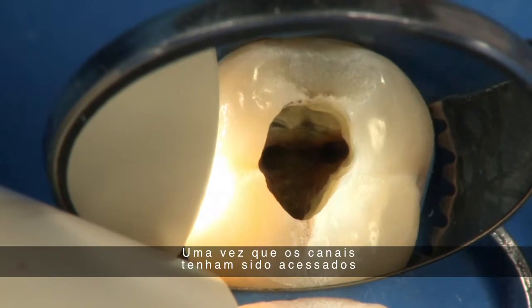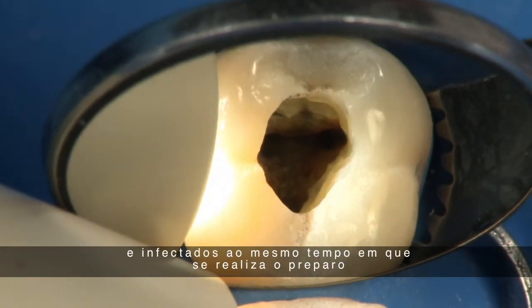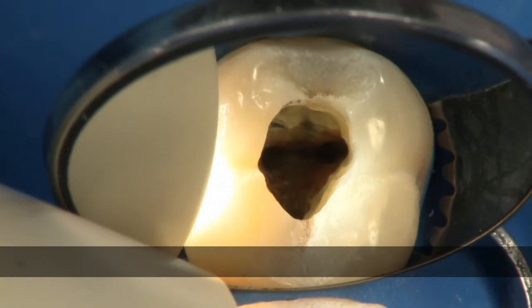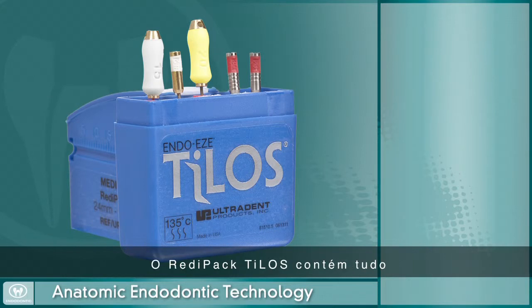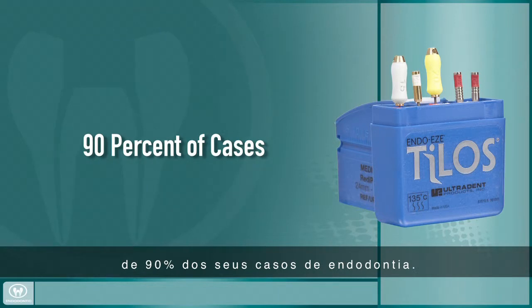Once the canals are accessed, it's time to begin instrumenting to remove all infected and necrotic tissue while properly preparing the canal for obturation. As a continuation of the anatomic endodontic technology, Ultradent has developed the Endo-Eze TiLOS file system. The TiLOS RediPack contains everything you need to reach the apex and properly instrument 90% of your root canal cases.